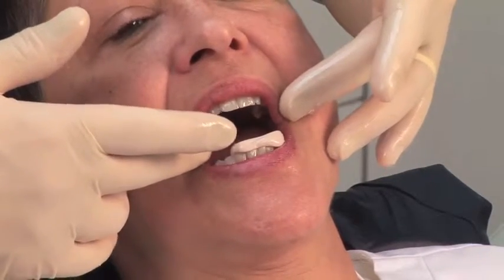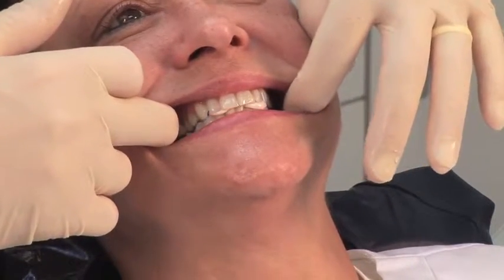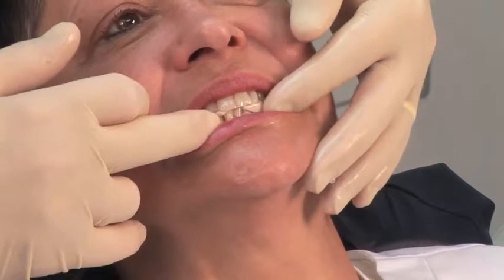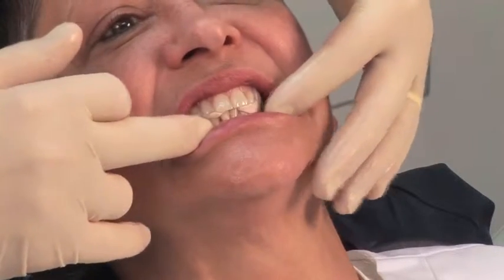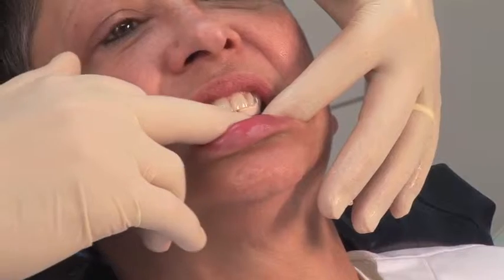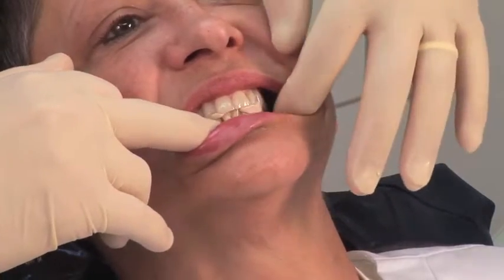I like to stay between cuspid to cuspid. I'll now ask the patient to close on their back teeth, nice and tight. You can see that we can form the material around her incisal edges on her maxillary teeth. Make sure that you don't have impingement of the tissue with your Thermacryl material. It's still in its plastic state, and we're going to want to chill that.